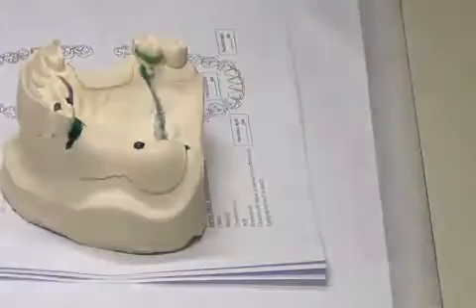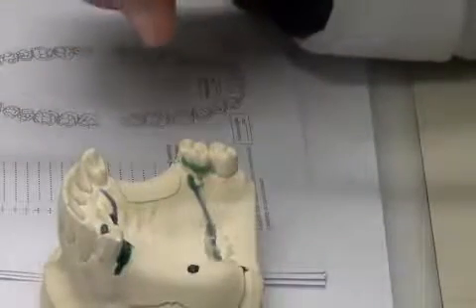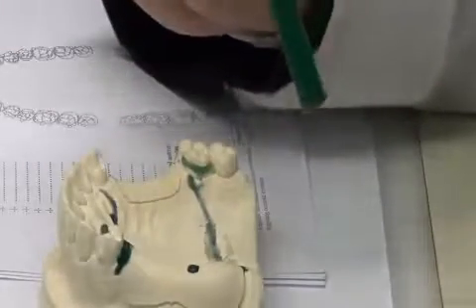The cast came, the patient came and I took an impression. This is the cast there. Okay, what we are going to do to this cast? Survey. Okay, so one of the steps is surveying. This is an initial step.